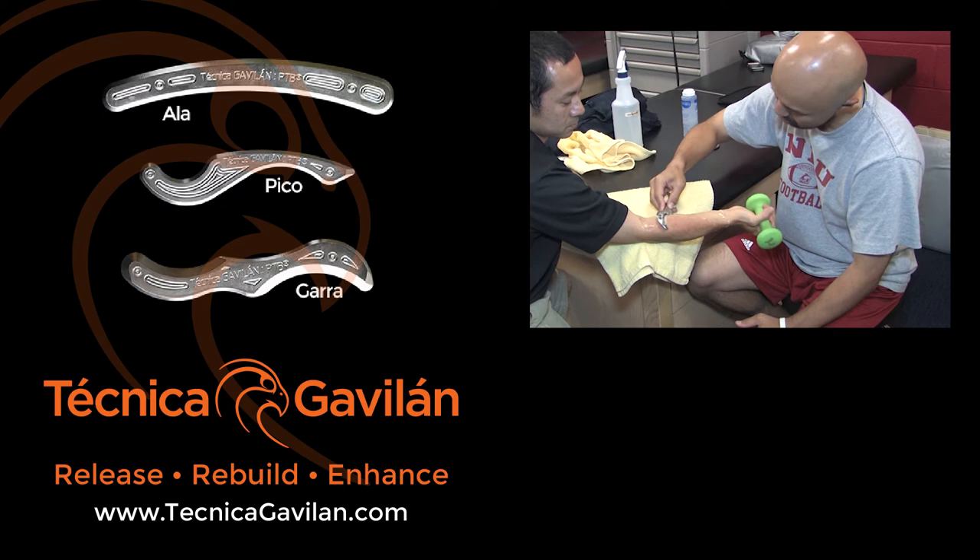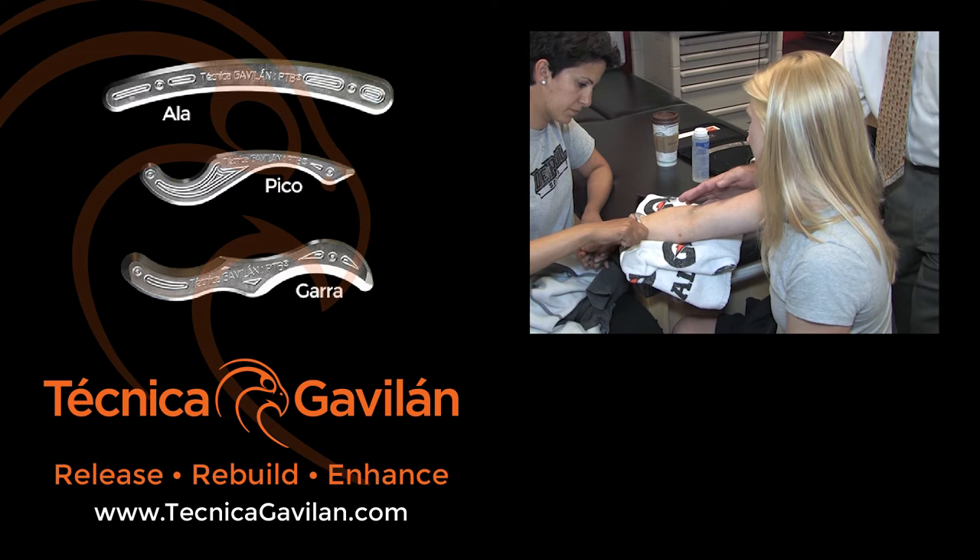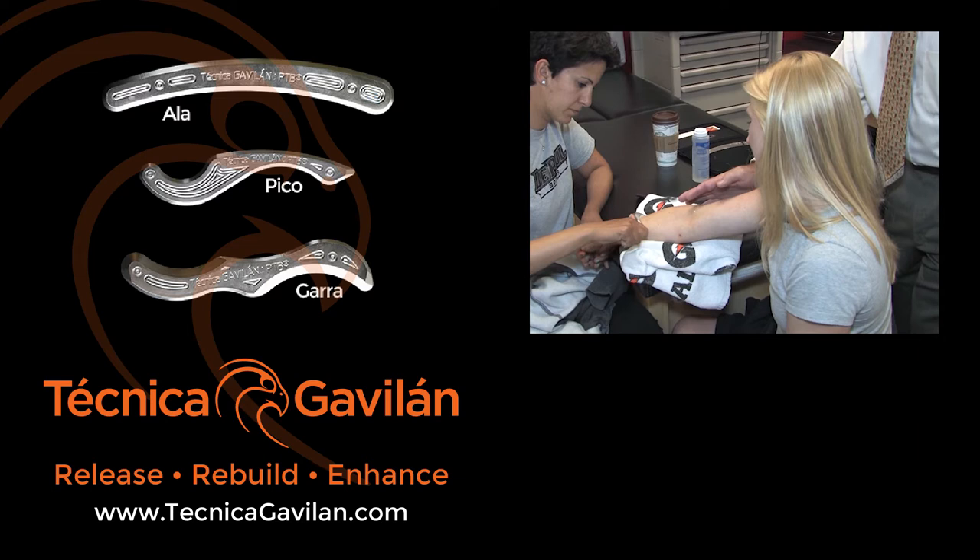I don't have to move or adjust my position and I'm not as tired either. Long and short strokes work real nice. He's going to get a little red and that's okay. You can use the instruments and if you felt like the curve wasn't fitting her lateral bundle, you could easily switch to a different tool.